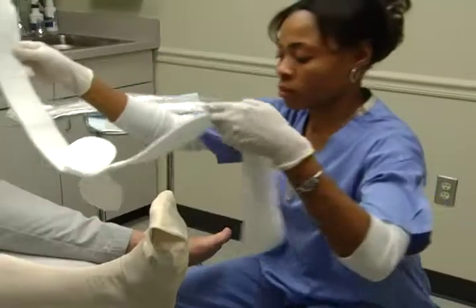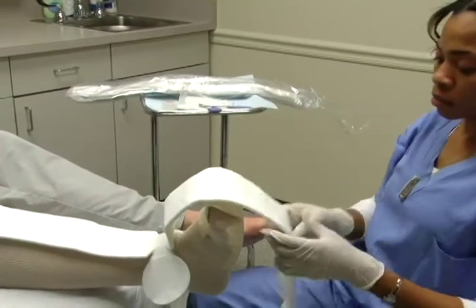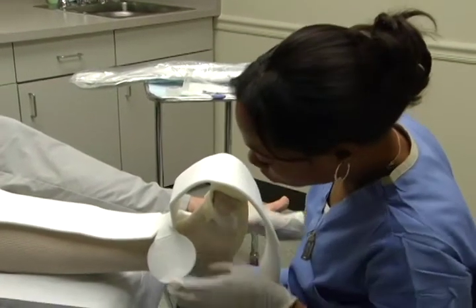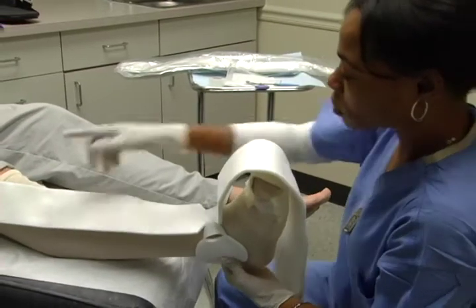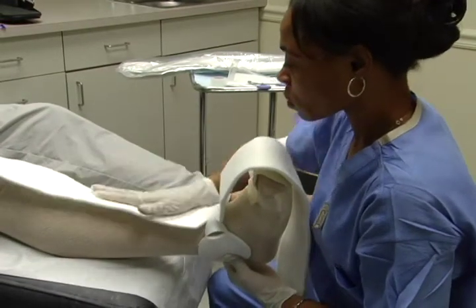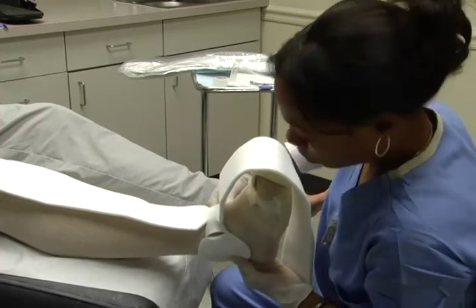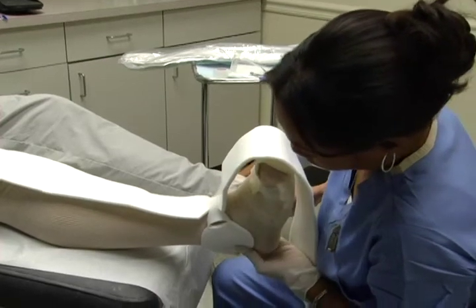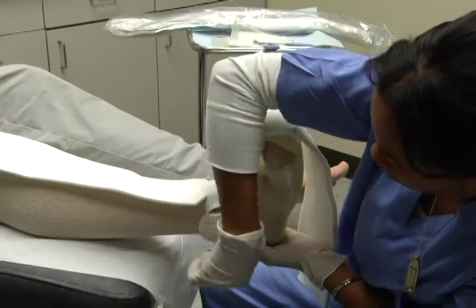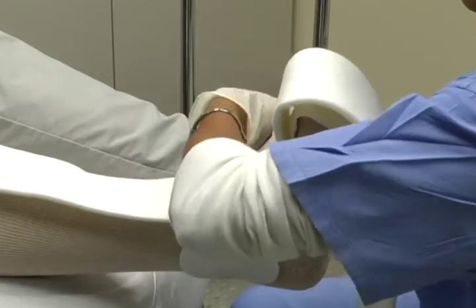Step 3. Protective felt pad. At this point, the patient is asked to hold their foot perpendicular to the leg. Apply the protective felt pad with the shorter, narrower portion to the tibial crest, over the dorsum of the foot, and along the bottom of the foot past the heel, ending at the Achilles tendon. Ensure that the malleolar discs cover the bony ankle prominence and anchor the pad with the plastic tape.